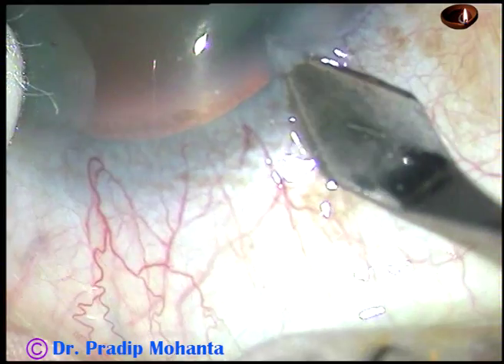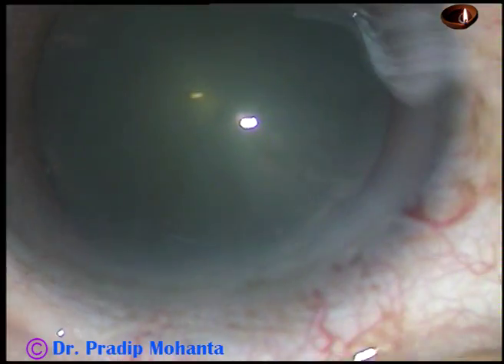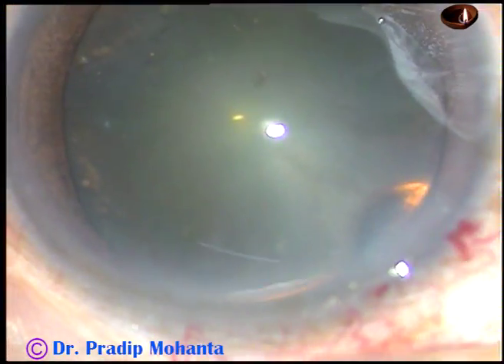This is the main incision on the posterior aspect of the limbus, and this is a 2.8 mm incision. Viscoelastic substance, 2% HPMC, is injected into the anterior chamber.